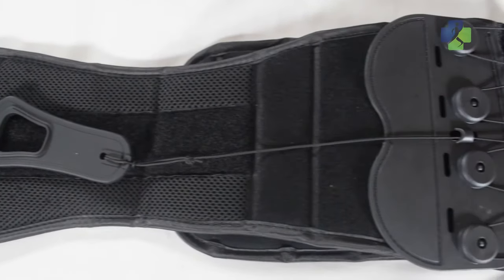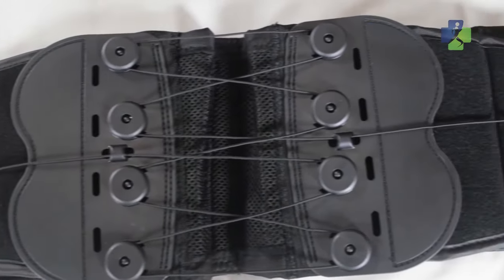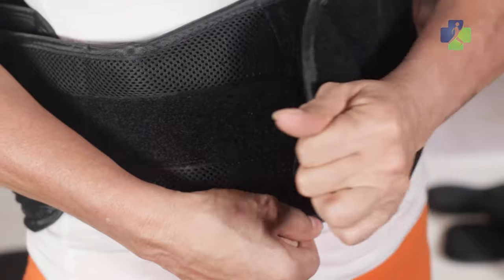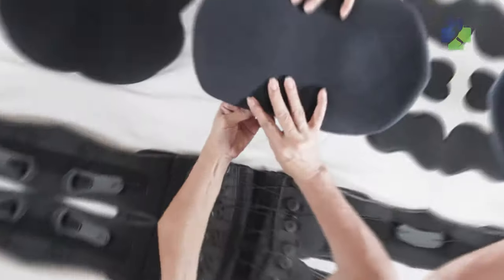Designed to keep you cool and dry, this brace is constructed with plush and breathable materials. The medical-grade fasteners are 10 times as strong as retail-grade fasteners, so you can count on a secure fit.